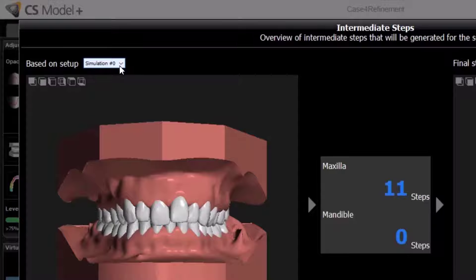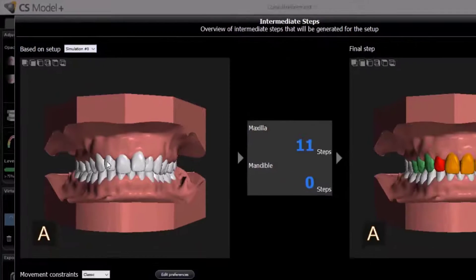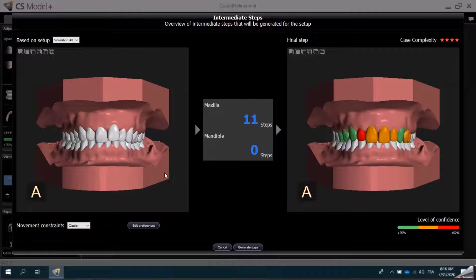If I had performed several different treatment simulations, I could switch between them. Now that the calculation is complete, you can see that this treatment will take 11 steps.